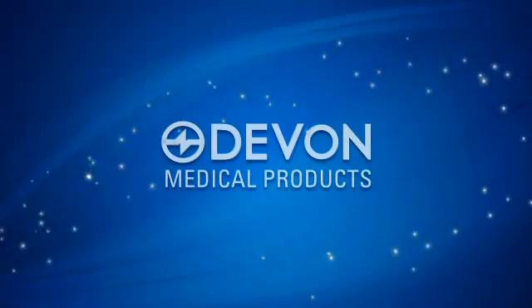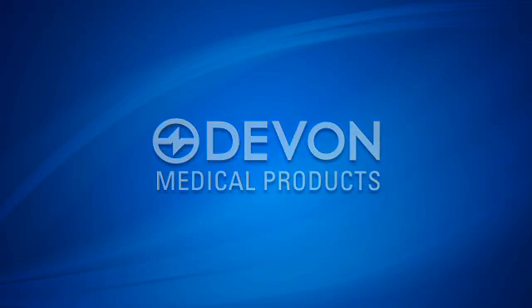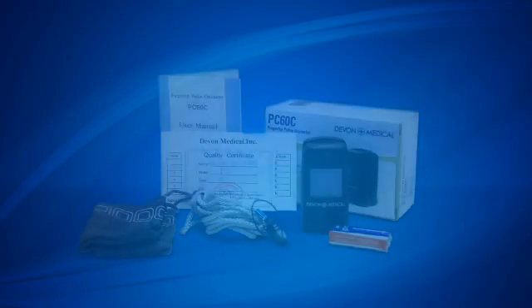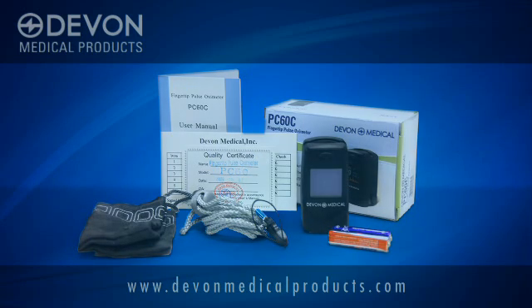Pulse oximeters by Devon Medical Products are used to measure oxygen saturation in the blood. All of our pulse oximeter models come with a lanyard, two AA batteries, and a detailed manual.